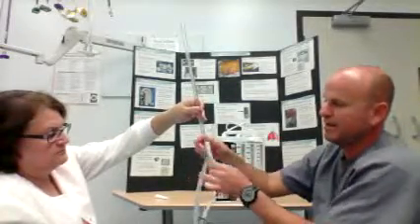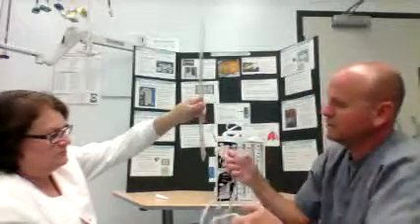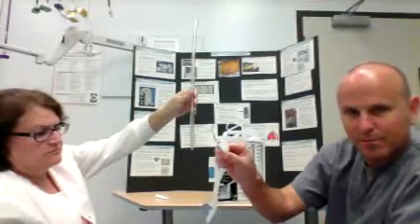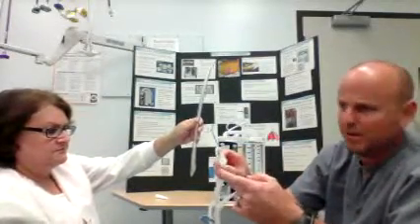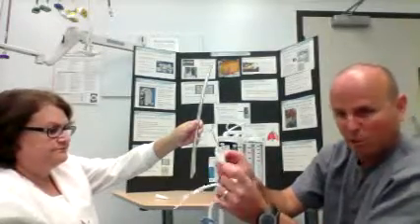The other thing that taping this way does is it totally obstructs your vision of what we call the football here. In this tubing, this is the smallest diameter portion. So if you have a lot of fibrinous material coming out, if a clot is going to develop and occlude your drainage, it's probably going to be in here. So you want to be able to see this part.